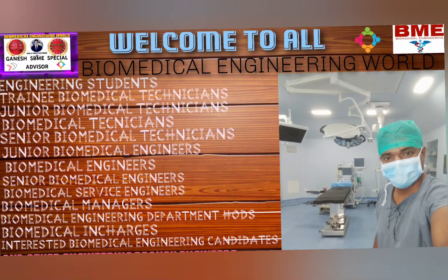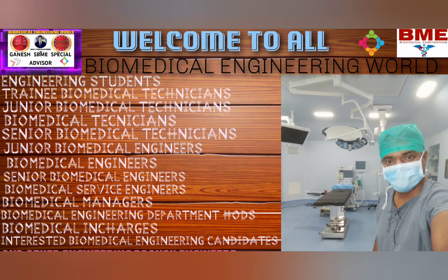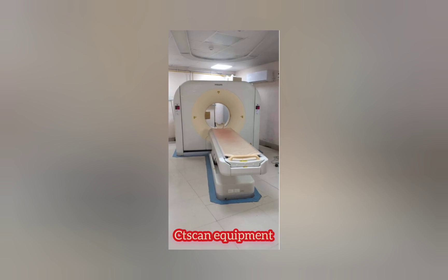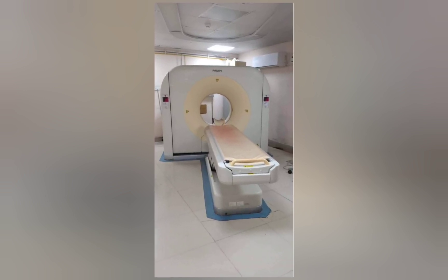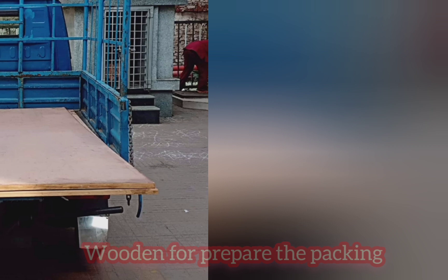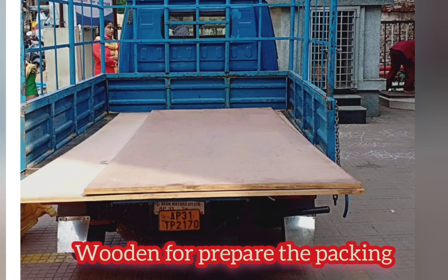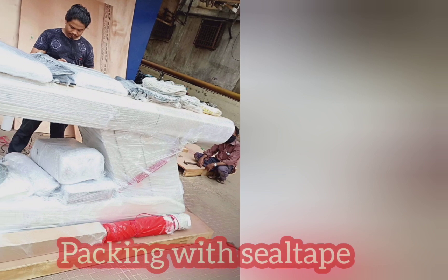So part one, part two, part three — and now in part one it will cover one topic: CT scan equipment dismantling, already covered previously. Now in this video it will cover all pictures regarding the CT scan equipment wooden packing process and transportation — how the transporting happens.